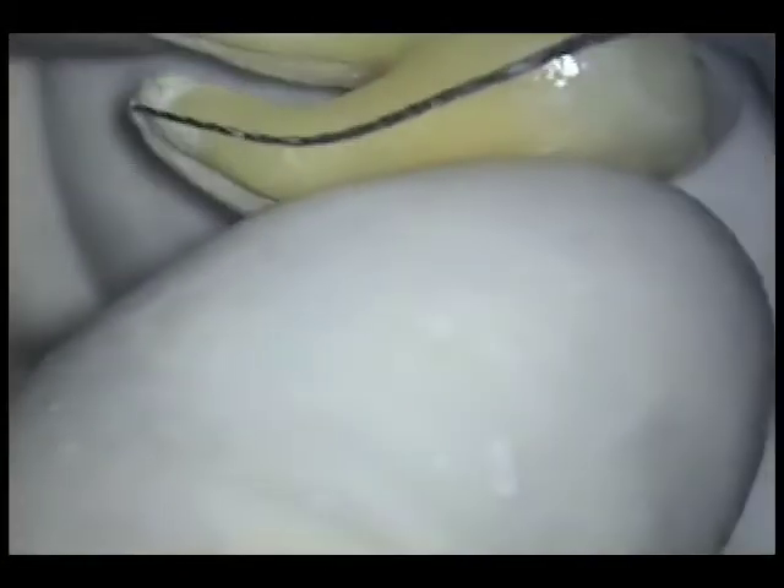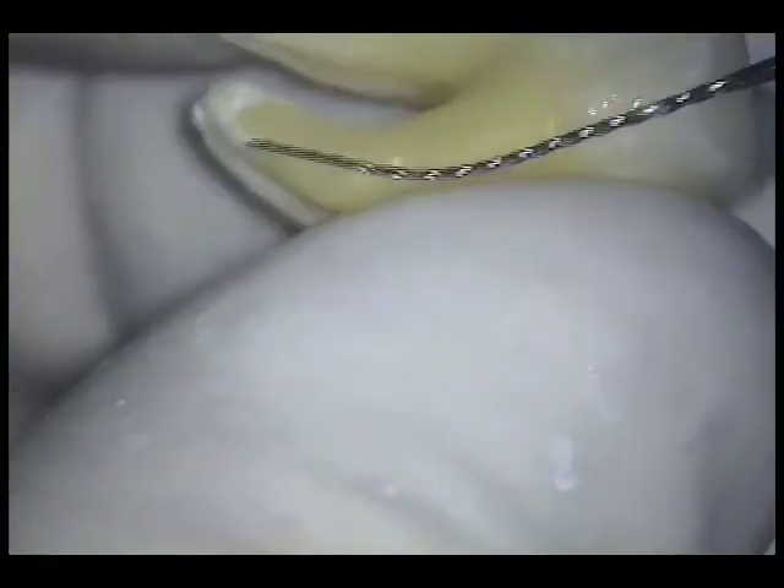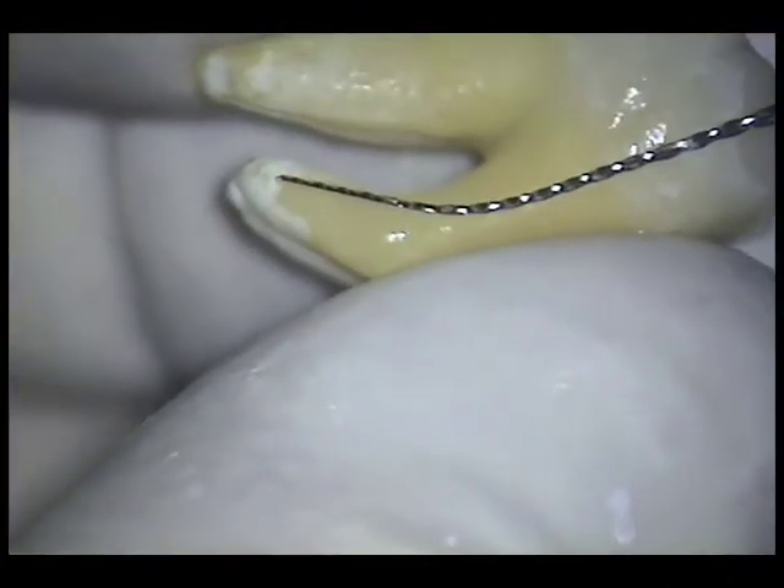When a No. 25 relieved reamer was placed in the canal 1 mm beyond the terminus in this case, it first hit a wall. So I bent it to conform and reattached it to the reciprocating handpiece to more easily shape the walls of the canal.